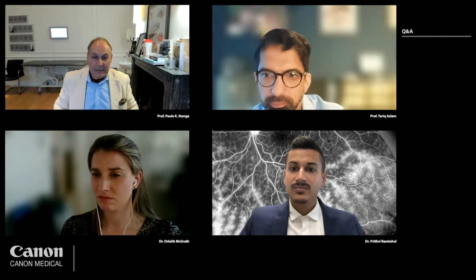Now, there's a question that has just shown up that ties well with your question, Tariq. It says, Professor Stanga, do you really think that peripheral OCT is superior to indirect ophthalmoscopy in investigating peripheral lesions? I have experience with Spectralis platforms since years, and even if OCT often discloses unexpected surprises, it is often difficult to image very peripheral lesions. Yes, that's why we cannot replace indirect ophthalmoscopy, but we can complement indirect ophthalmoscopy. We should not think of replacing, we should think of complementing.